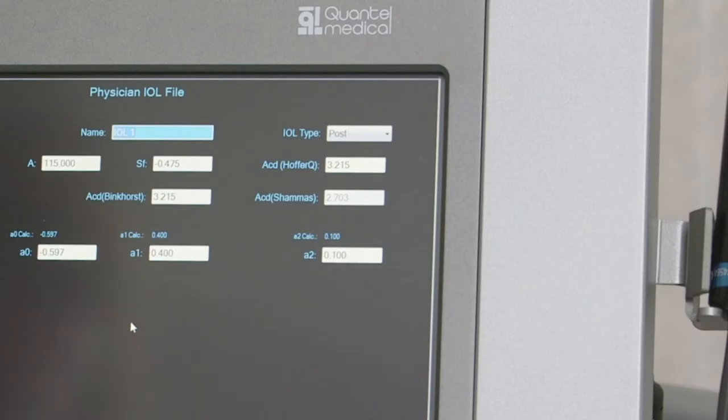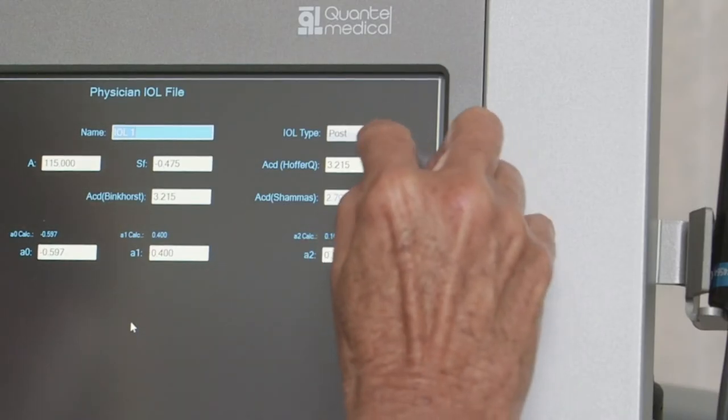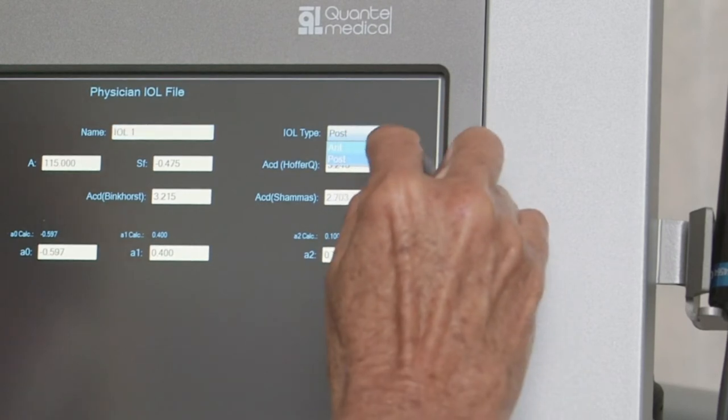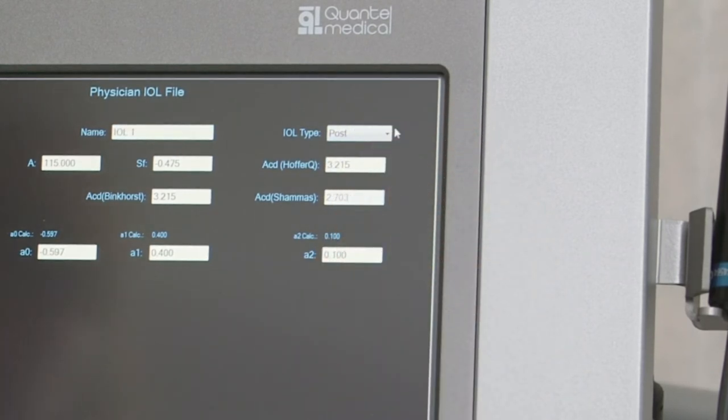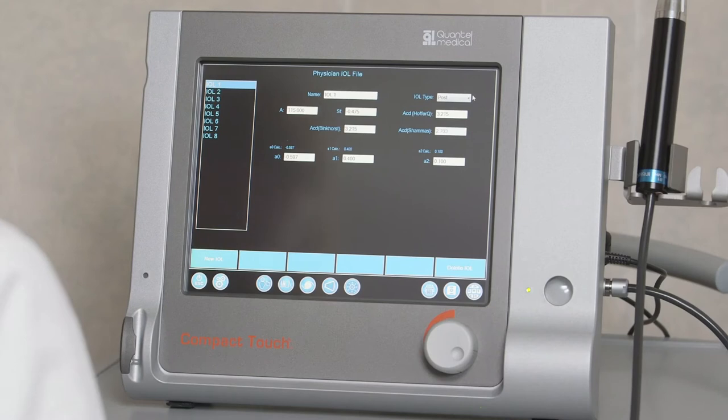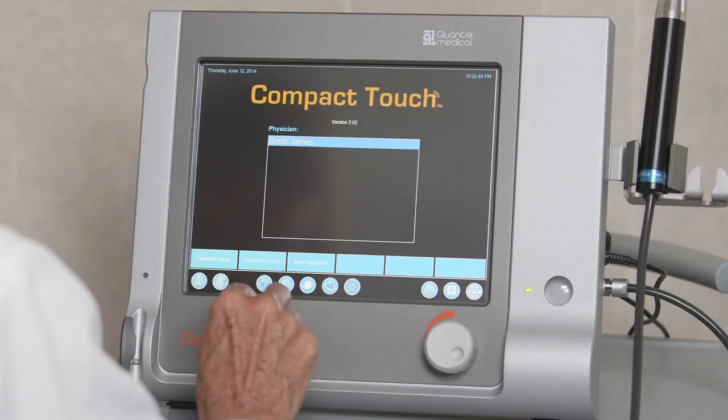In Biometry mode, the Compact Touch can calculate up to four IOLs at a time. Using the pull-down menus on the IOL Setup page allows the examiner to enter IOL information and choose an IOL power calculation formula. The examiner can also create, modify, or delete an IOL file by selecting IOL File on this page.